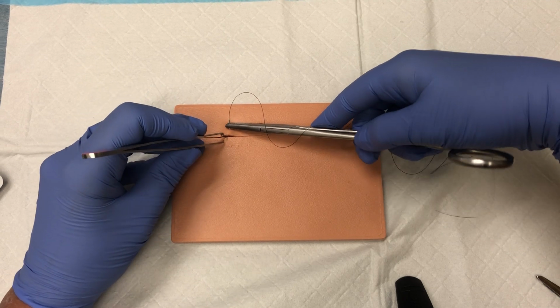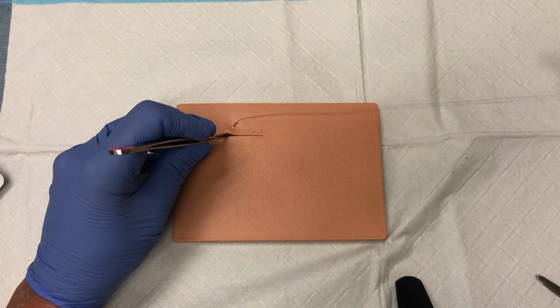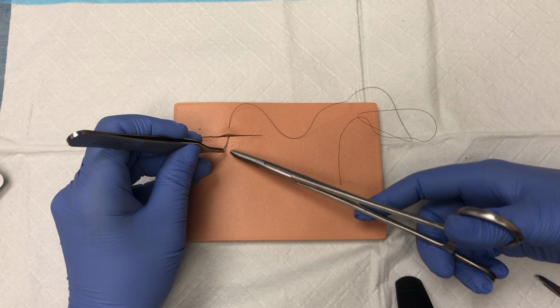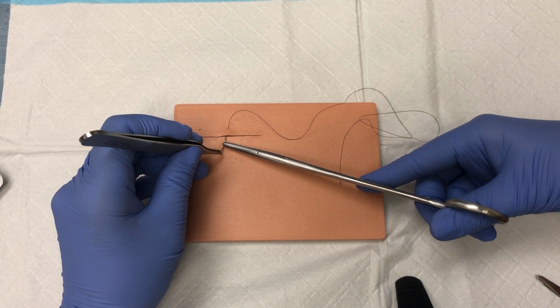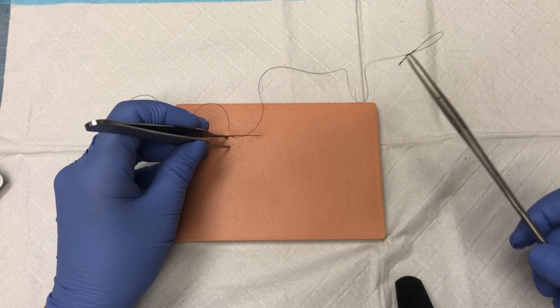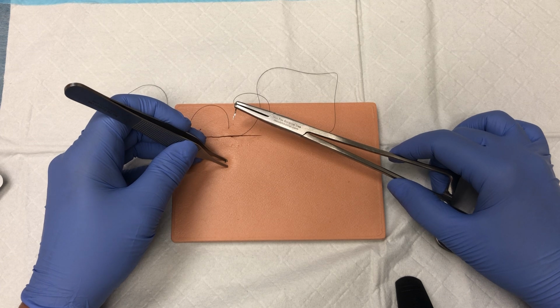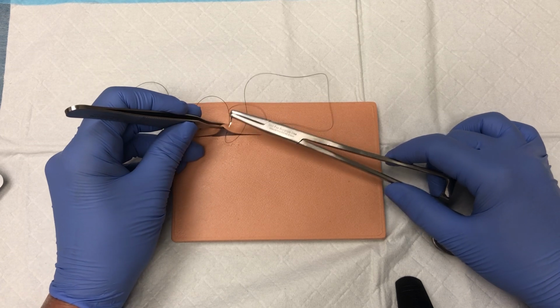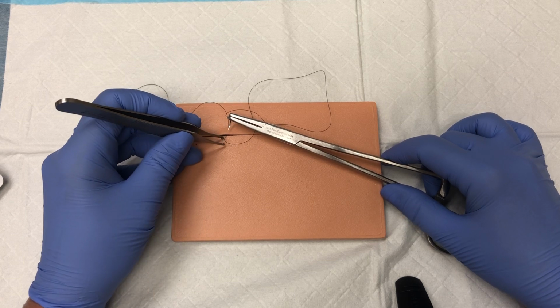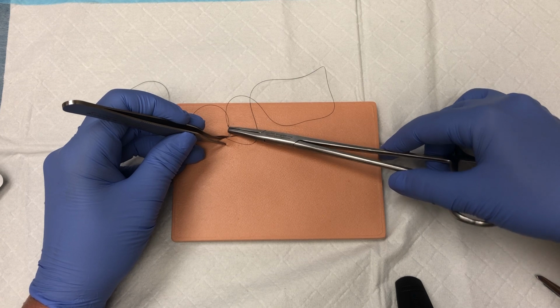Grab the needle with your pickups. Again, do not grasp the tip of the needle. Pull that needle out and re-secure your needle driver. And as we go back into the skin for the side that is toward us, it's very important that we keep an eye on where we exited the underlying tissue on the side that is away from us, so that as we enter the tissue toward us, we are keeping things symmetrical.